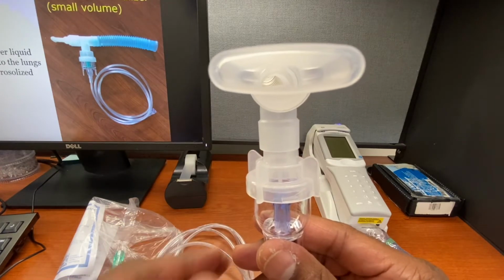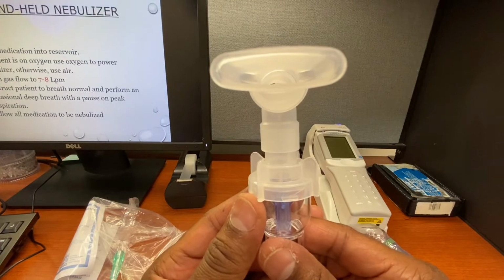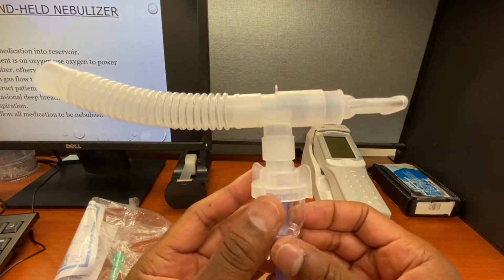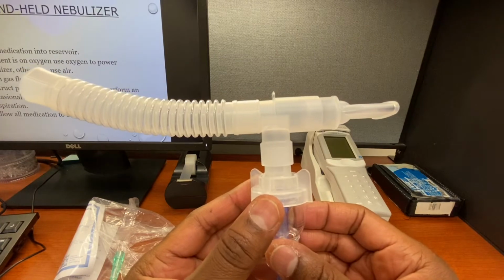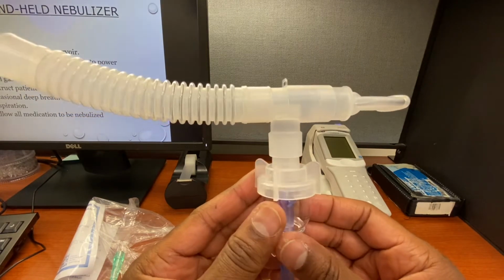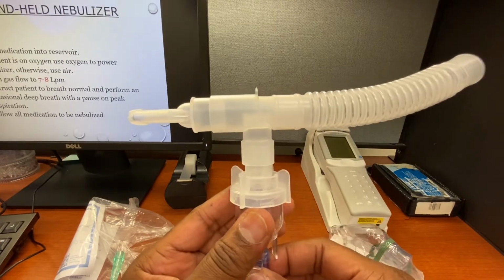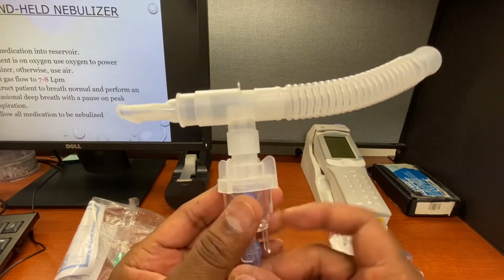And if you remember from the slide, instruct the patient to breathe normally and perform an occasional deep breath with a pause on peak inspiration, okay? And so that's how they take the medication. It'll last for about 8 minutes, maybe 10 minutes, depending on how much you put in the reservoir.